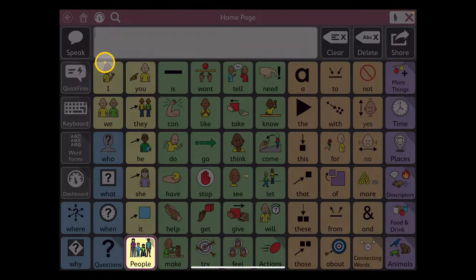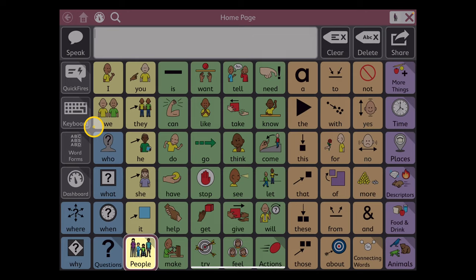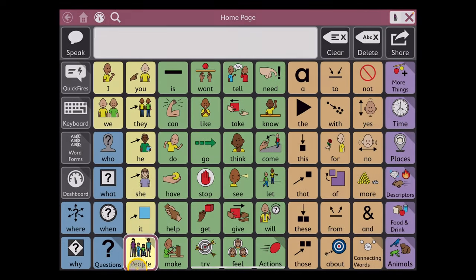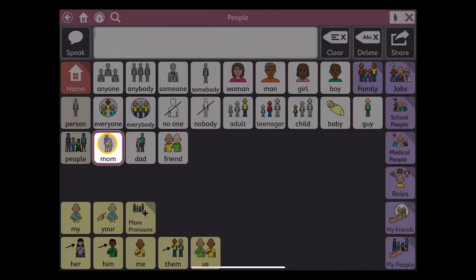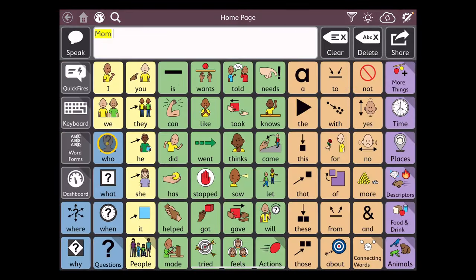Once you make a selection of the search term, it will guide you from the page you're on to locate that particular vocab word.